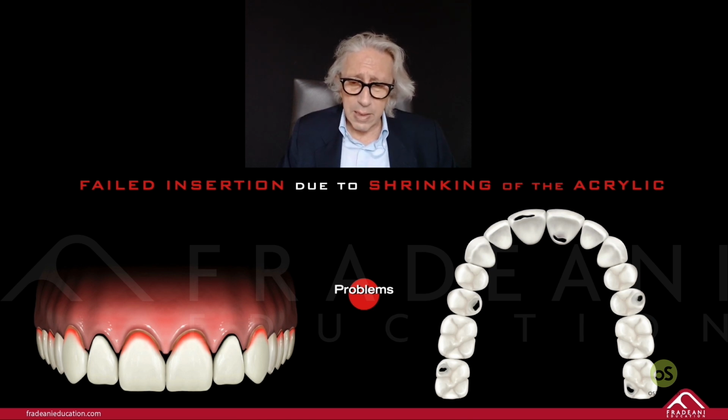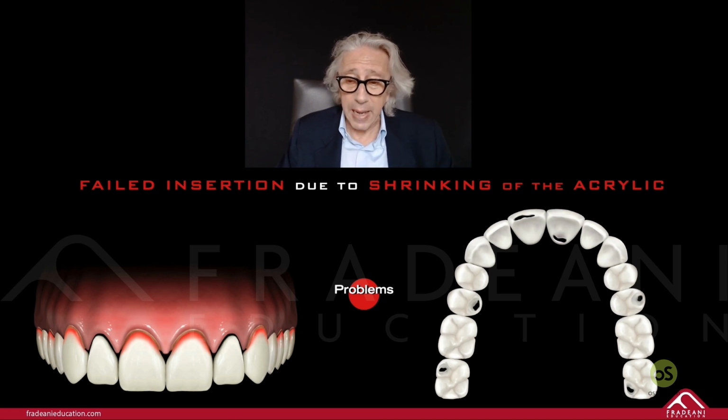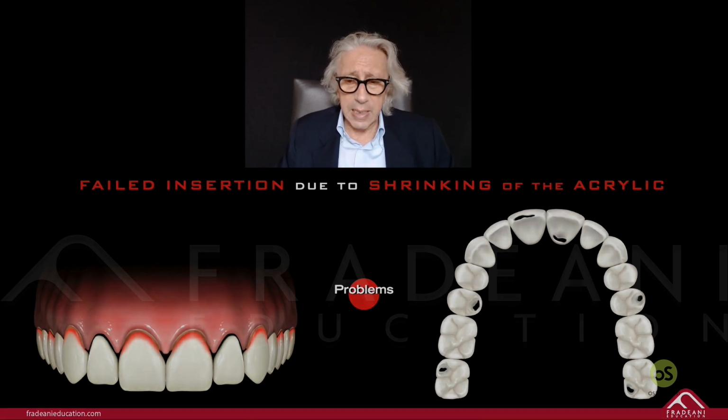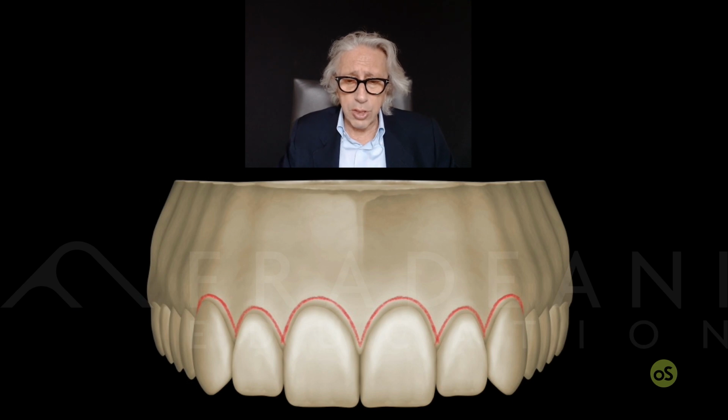You start to open some holes. You start to re-prepare the teeth. The patient will complain because maybe they have no more anesthesia in the classic traditional way of the preparation. So it's something that maybe you have experienced at least once, that it is very complicated to insert the shell completely before aligning. And that is a big problem. But to avoid this problem, you should change something.